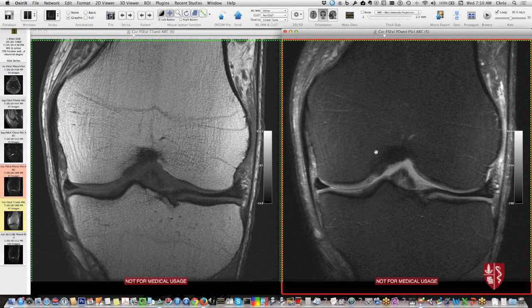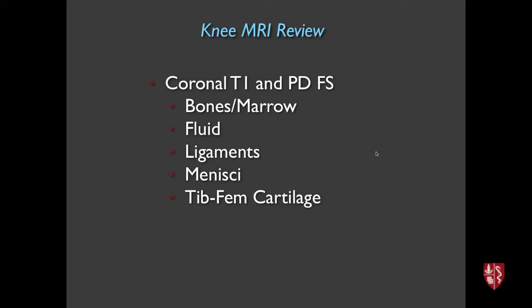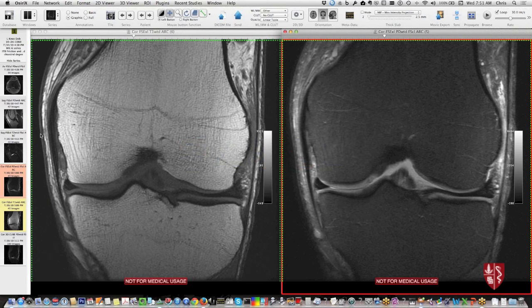Having gone through bones and marrow, ligaments, menisci, and tibiofemoral cartilage on coronals, I then move to sagittal images. The goal is to reinforce what was seen and look for other things not previously visible. On sagittals I go through the medial compartment looking at meniscus and cartilage again, sweep through the intercondylar notch for the cruciate ligaments, go to the lateral compartment, and then turn attention to the extensor mechanism and patellofemoral cartilage.